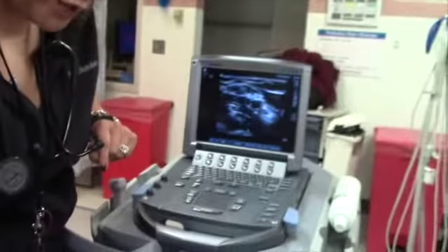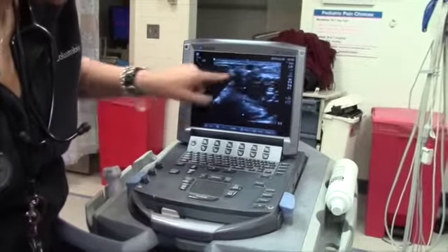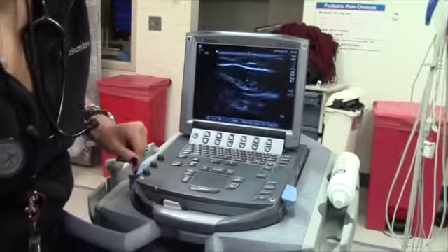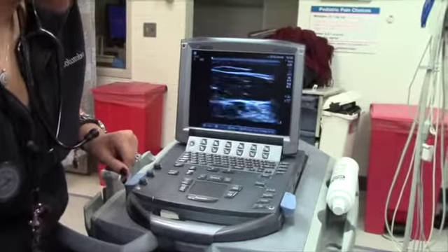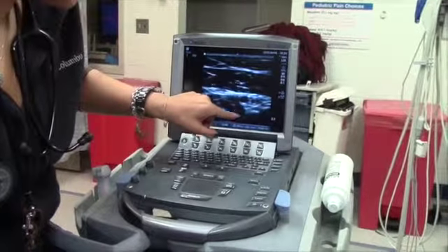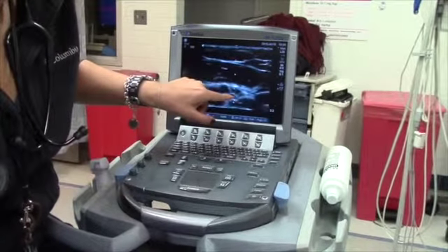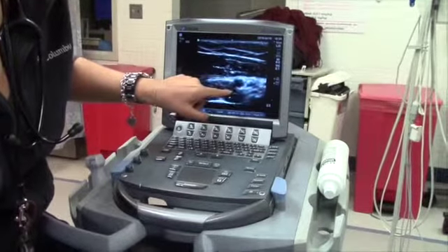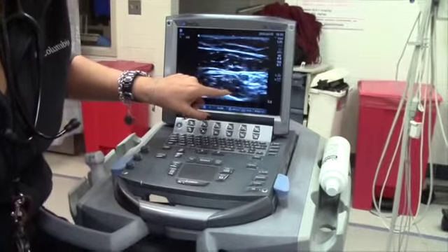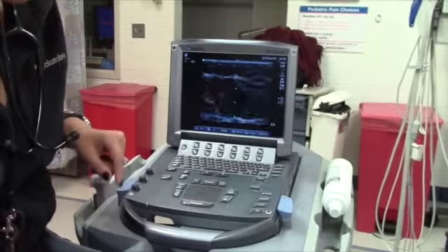So these veins right here are pretty superficial, so typically a nurse is not going to ask you for help finding these, such as this one, but usually we'll be looking a little bit more deeper in the bicep area for some of those larger, deeper veins. Down here is an artery, but next to it should be a vein. Oops, sorry, it's sliding around. Sometimes they're right on top of each other as well. Okay, so fluid, black, tissue, gray, bone, white, as we demonstrated earlier.